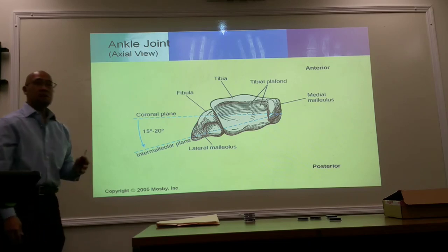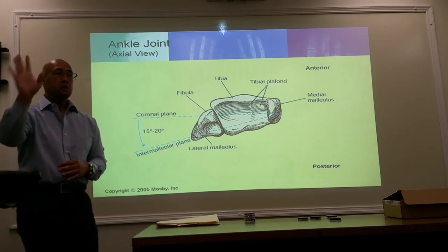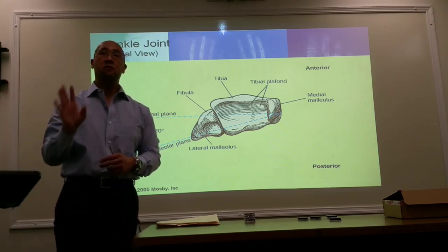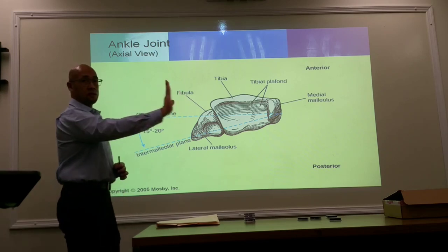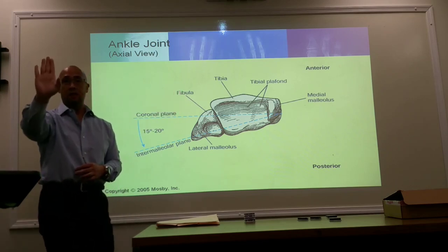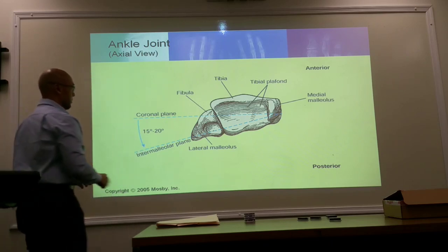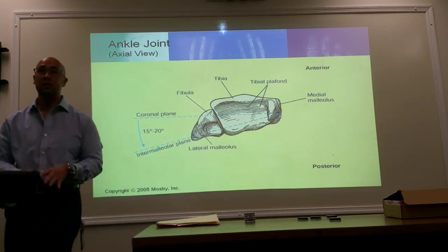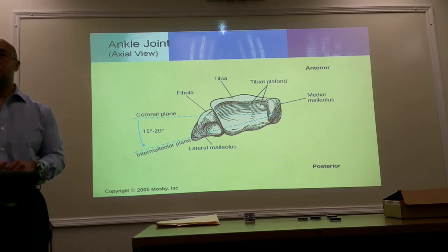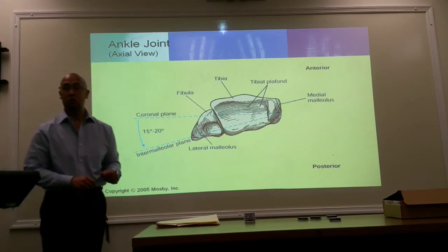In a true AP projection of an ankle, your toes are pointed up. So again, when we're taking an x-ray of your ankle, your foot is going to be dorsiflexed with your toes pointing up. This is a true AP of the ankle. Now in a true AP of the ankle, you're not going to see the joint space very well. There is going to be some slight superimposition of the distal tibia and fibula.